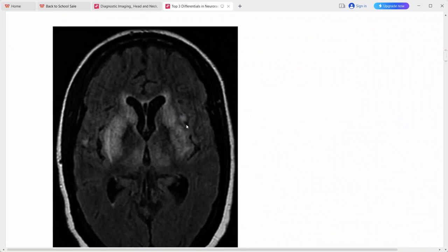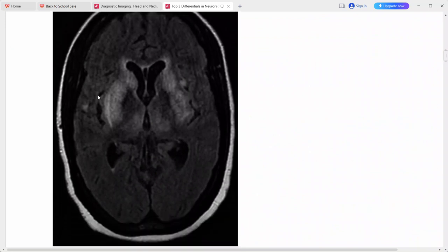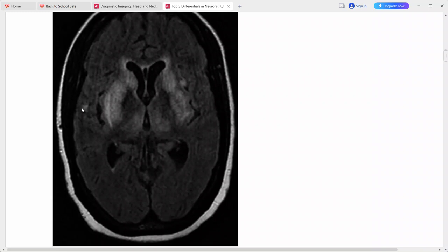This is an adult man presenting with altered mental status. FLAIR axial MRI at the level of the gray matter structures shows symmetric regions of increased signal intensity involving the bilateral thalami, lentiform nuclei, caudate, sub-insular white matter, and foci in the left insular cortex and right operculum. The top differential for symmetric basal ganglia and thalamic signal in an adult is viral encephalitis. Hypoxic ischemic injury, osmotic demyelination, Wilson's disease, or Creutzfeldt-Jakob disease can also be considered.